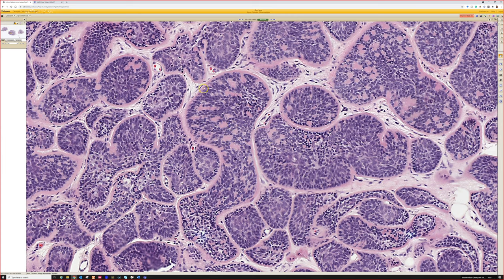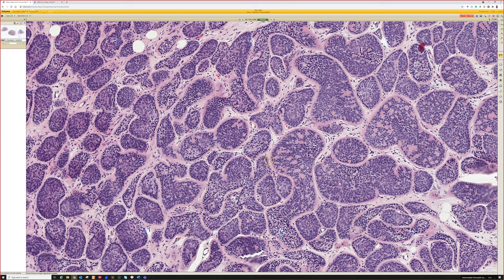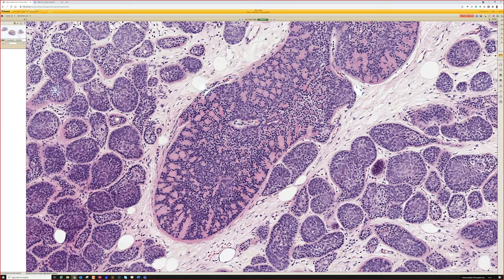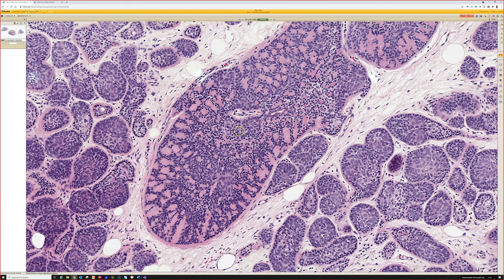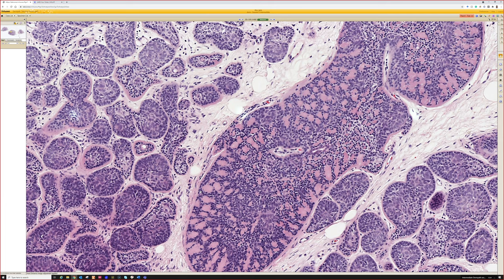But in any case, the pink layer on the outside, and then look, these blobs or globules or droplets, whatever name you like, of pink basement membrane, collagen type 4, embedded in the tumor islands. Look at that. If you don't like that, I don't know how to help you. I mean, that's beautiful, right? That's amazing. So look, the other thing is that these are sweat gland tumors, but the ducts sometimes are very focal and small, whereas you have abundant duct spaces and cysts in hidradenomas. Spiradenoma and cylindroma tend to be very focal a lot of times.